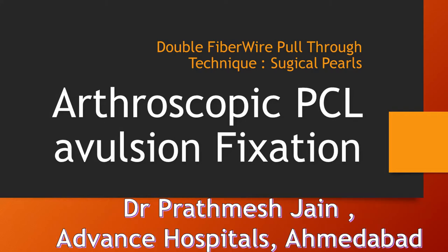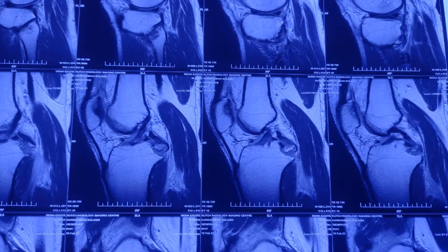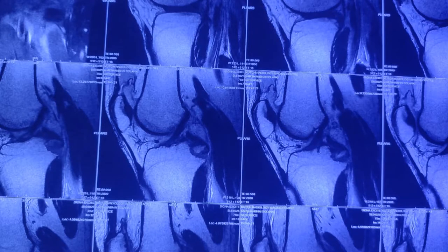In this video we will be demonstrating our arthroscopic surgical technique of PCL avulsion fixation using a double fiber wire pull-through technique. This is a young patient who suffered a road traffic accident with a dashboard injury, resulting in a PCL avulsion fragment located on the posterior side of the knee. The MRI findings are confirmatory, showing a significantly displaced PCL avulsion fragment.